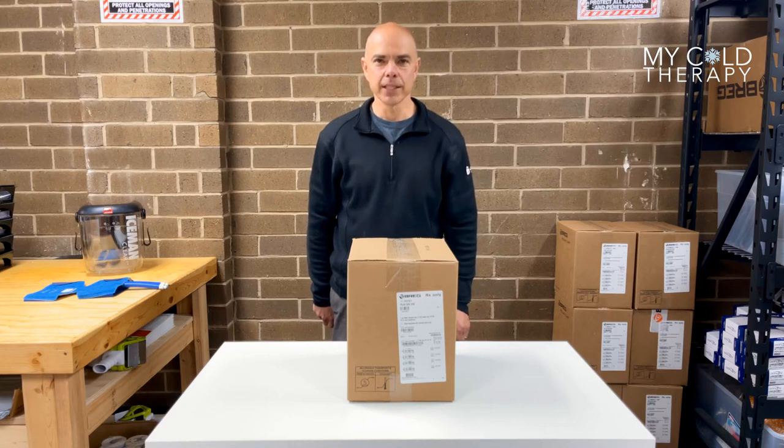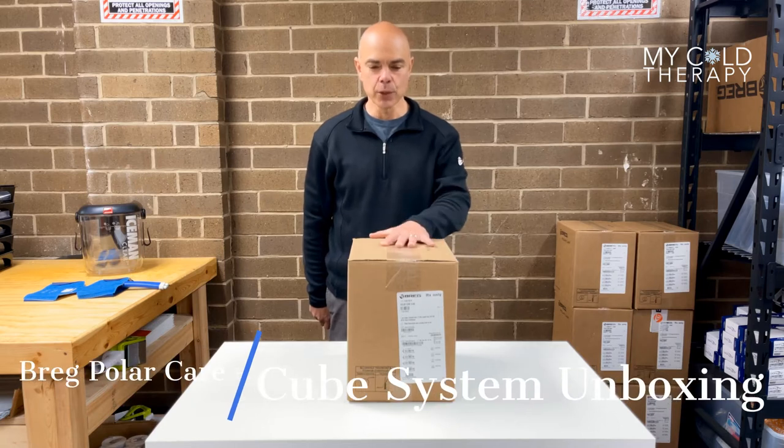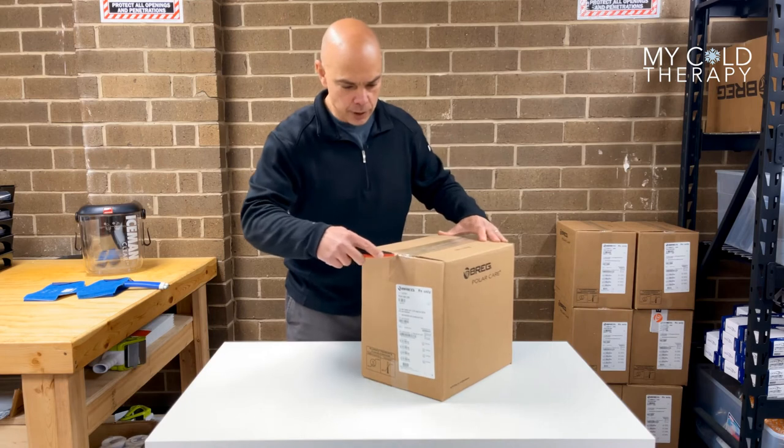My name is Steve from MyColdTherapy and today we're going to talk about the Breg Polar Care Cube System. This is what it's going to look like when you get it in the mail. Let's cut the box open and see what comes with it.